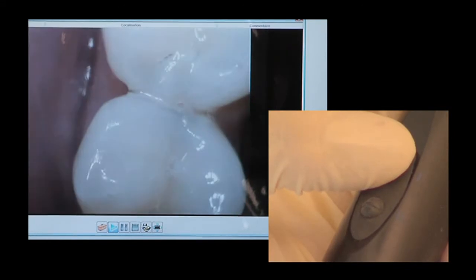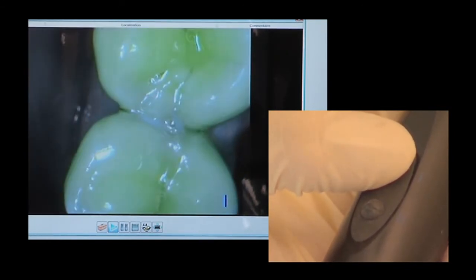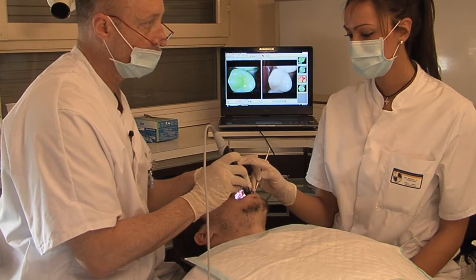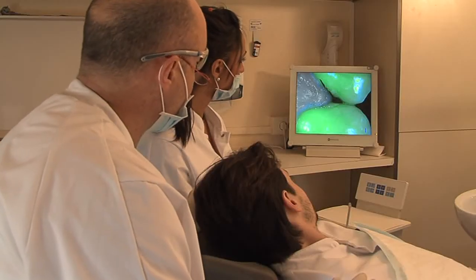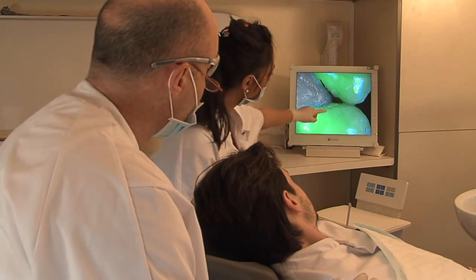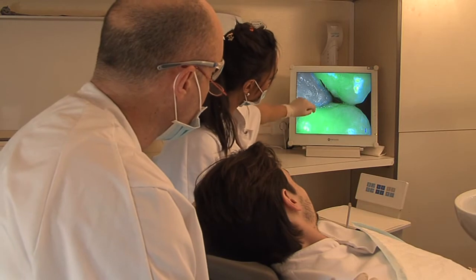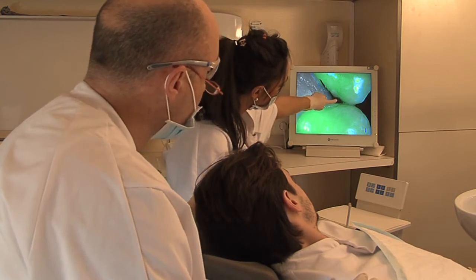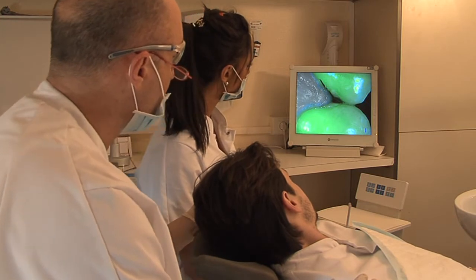Soprolife guides your diagnosis by revealing the presence or absence of carious lesions. What you must look at is, on one side, the healthy tooth represented by this bright green colour, and on the other side, the variation of the fluorescence. This is the dark area located between the two teeth, and it is at this level that the carious lesion is located.